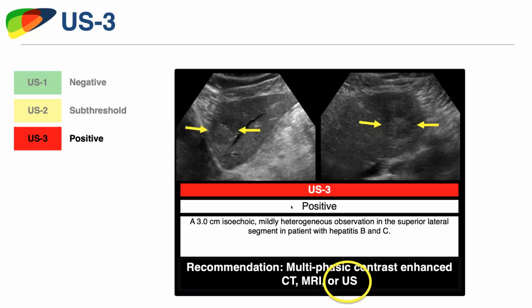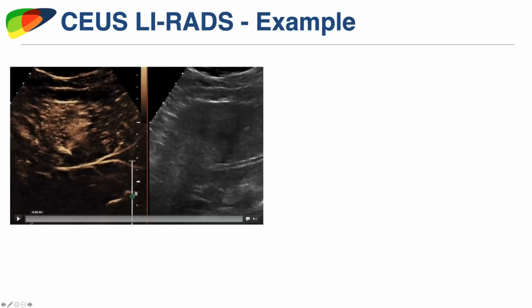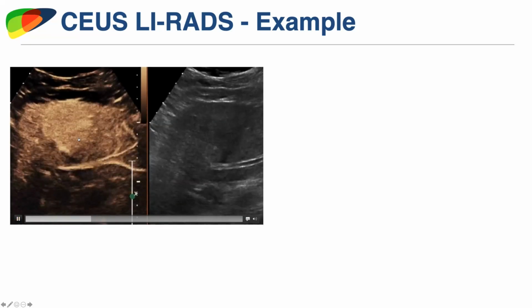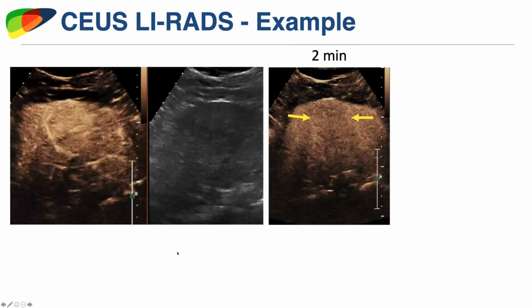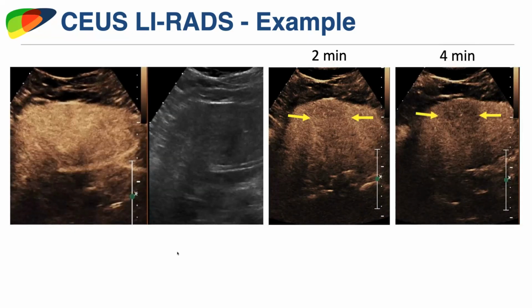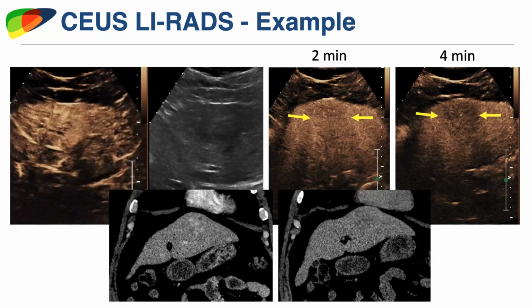And since we had this patient in our clinic, we sent them down the hall, started an IV, brought them right back into our overflow room, and did a contrast ultrasound study. And as you can see here, that observation showed avid, solid arterial phase hyperenhancement, and then mild, late washout. And as we'll talk about, this is diagnostic for HCC.